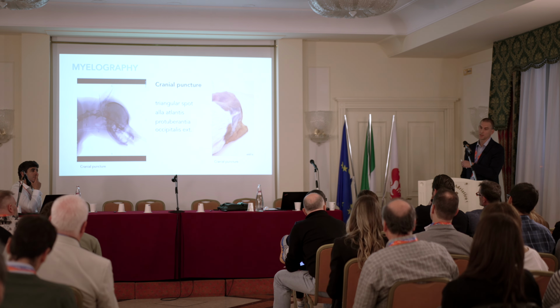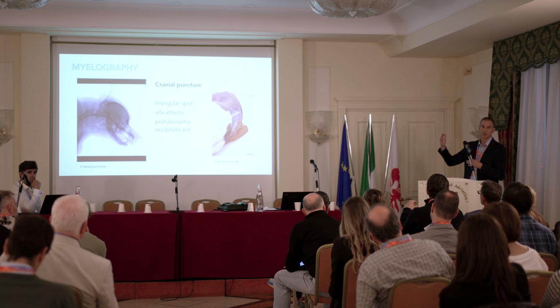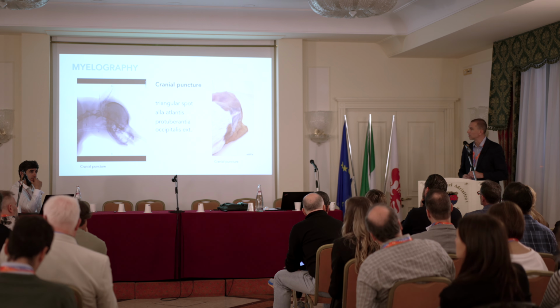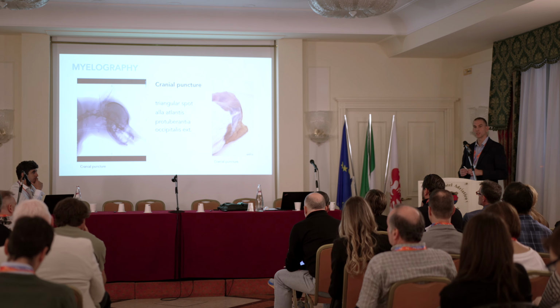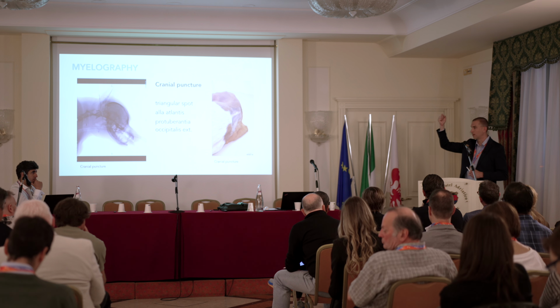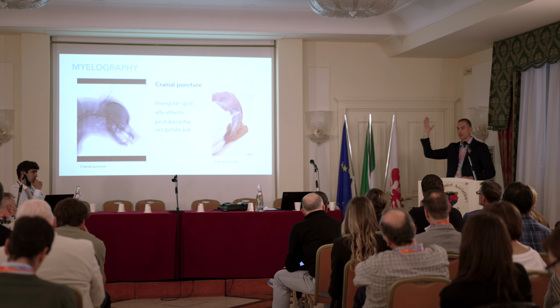For cranial puncture, my recommendation is that the head should be lifted up, and the gravity of the animal allows to go the contrast medium to the spinal channel, not to the head. Yeah. And after application, I hold the animal by hand for the head, and the standard position for 1 to 2 minutes is this.